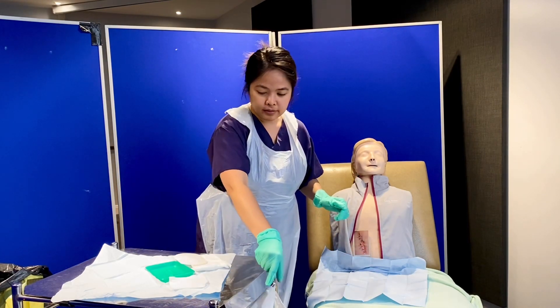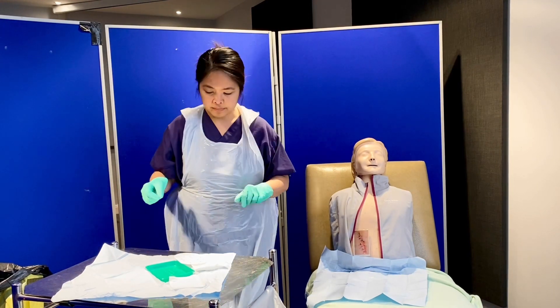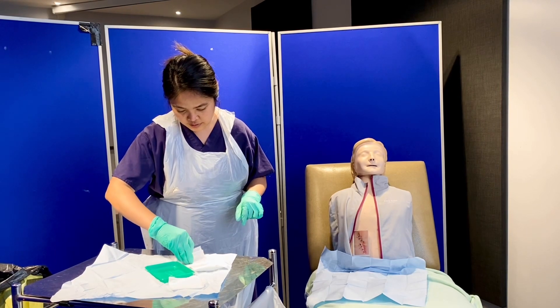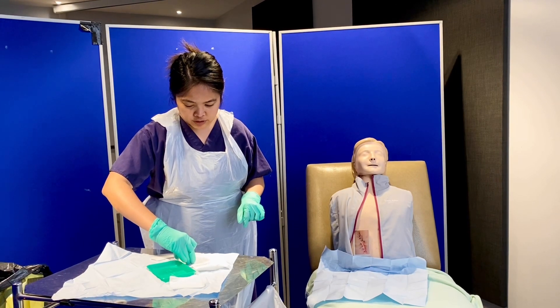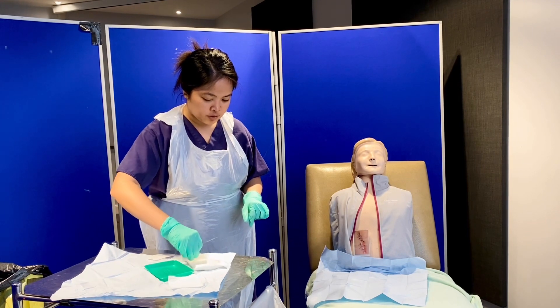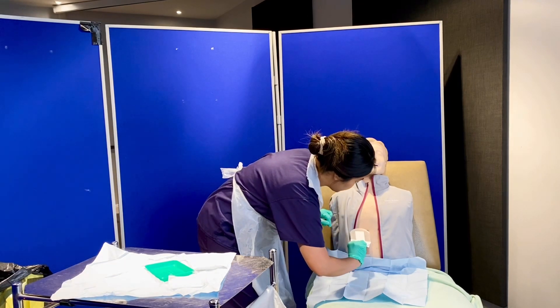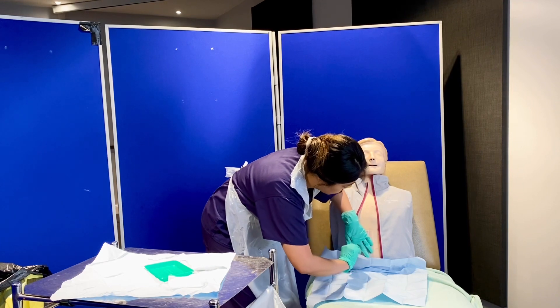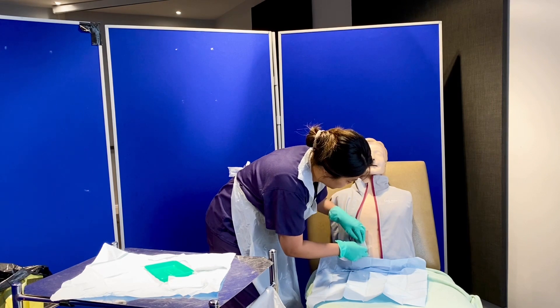I'll be getting the Opsite dressing now. I make sure to open it carefully, not touching the inside of the dressing, maintaining the aseptic non-touch technique. Are you ready? Yes. I'm securing the dressing now, securing it with my other hand. I remove the first backing and then remove the top backing of the dressing.